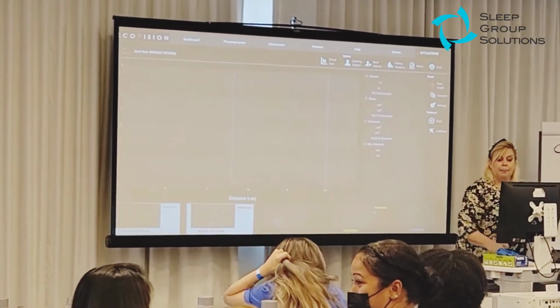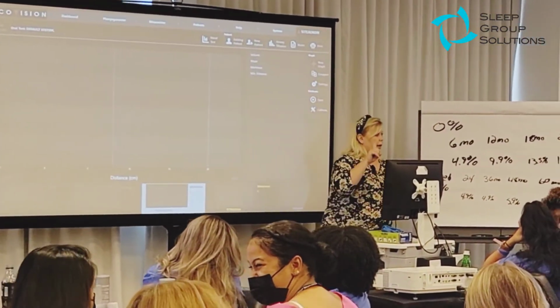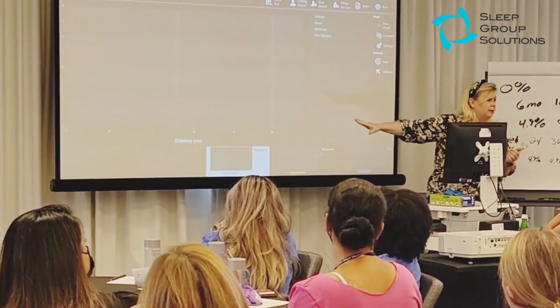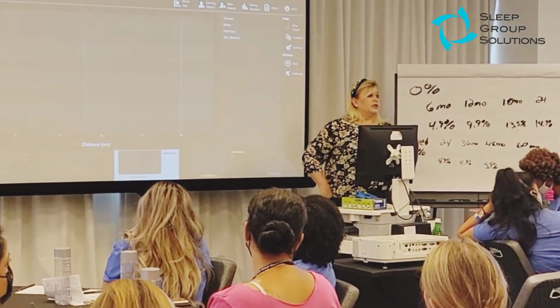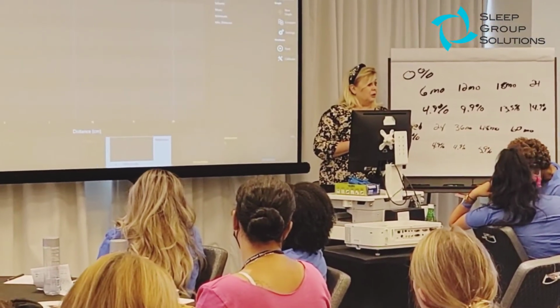So, okay, now, let's pretend. So walk this walk with me, okay? I'm going to move forward just a little bit in the protocol. So now, I found this patient has a really collapsible airway. I've issued a home monitor, and it's positive. Okay? So I've issued my home monitor, it's positive. I've talked to my patient about what the results are.